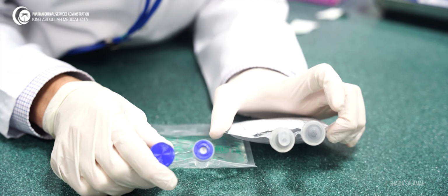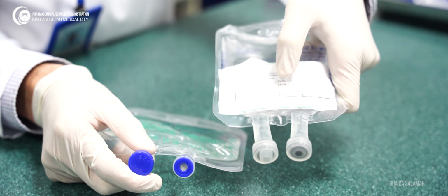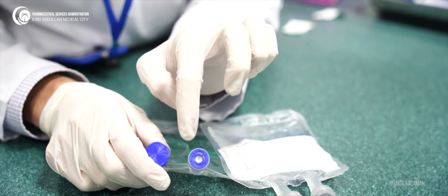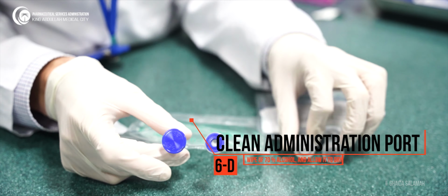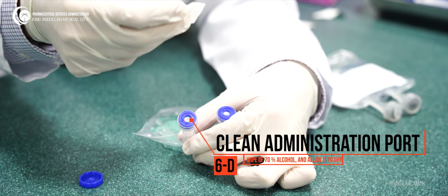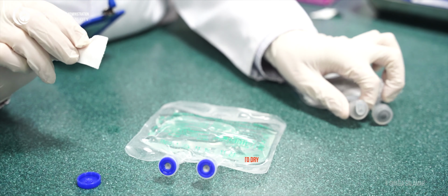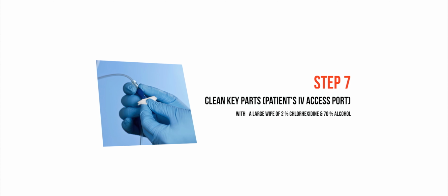When you receive a bag prepared from pharmacy, take care that there is an open port, which is the injection port, and there is an unopened or capped port. This is the administration port. You should use the administration port for administration of the medication to the patient. Clean the administration port first, 3 times in the same direction using an alcohol swab. Return back to the steps of preparation. You should clean key parts of the patient IV access using an alcohol swab with chlorhexidine.